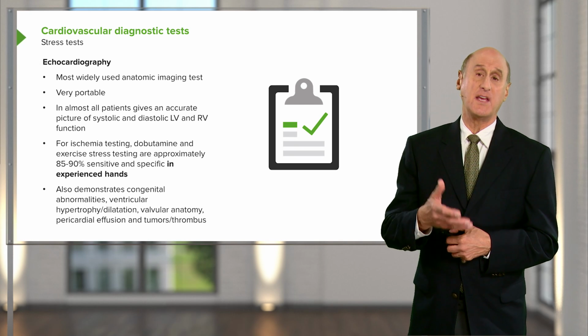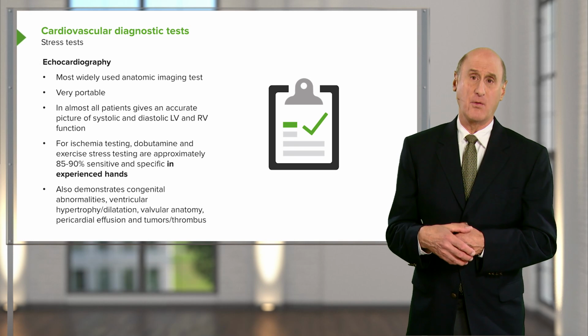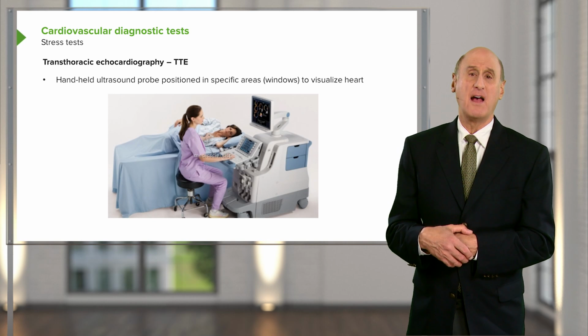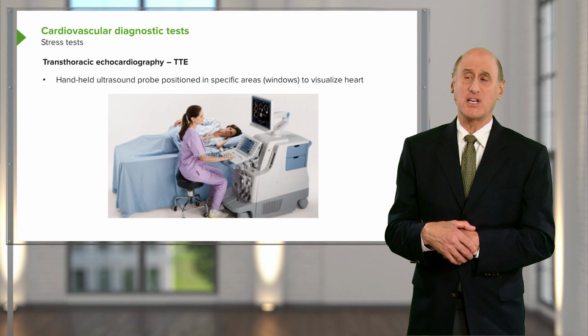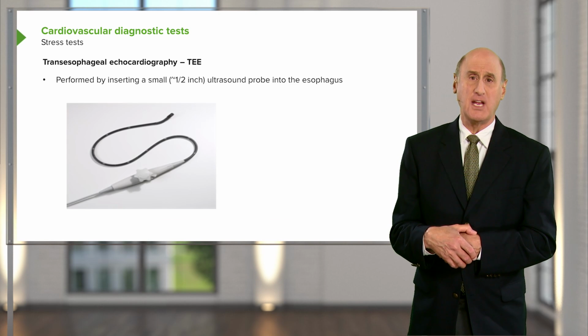We also record the ECG, by the way, during this, so we have both the ECG information and the echo information. And here we see the patient getting an echocardiogram. They may have just finished exercise, they quickly lie down, and we record the echocardiogram with a very modern echo machine.